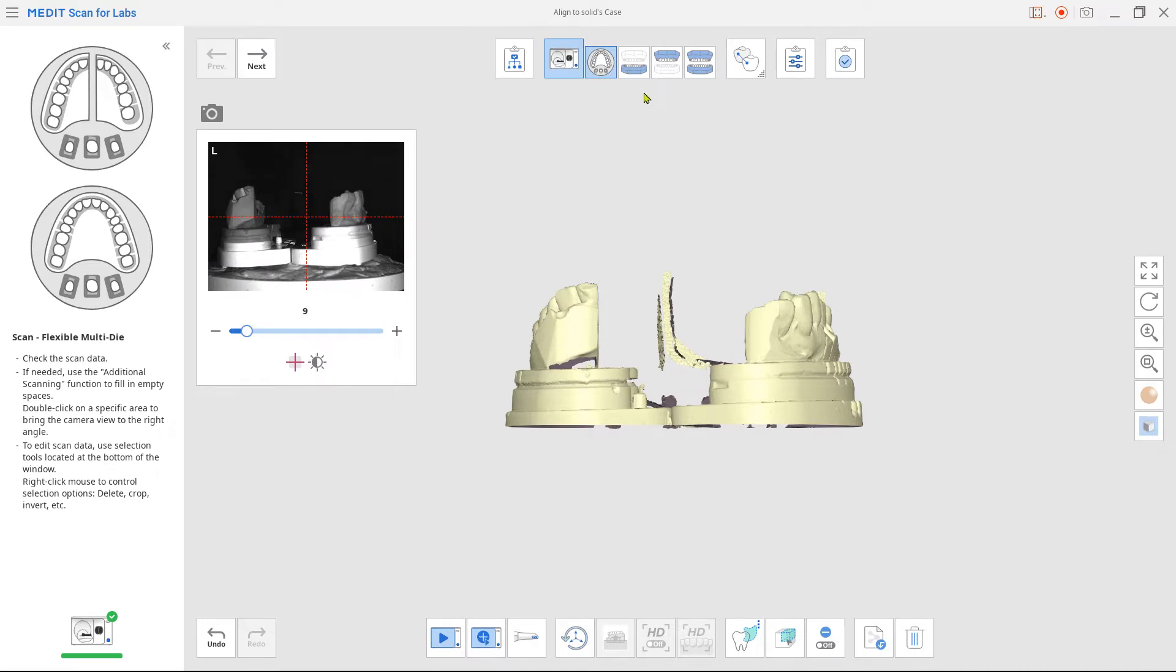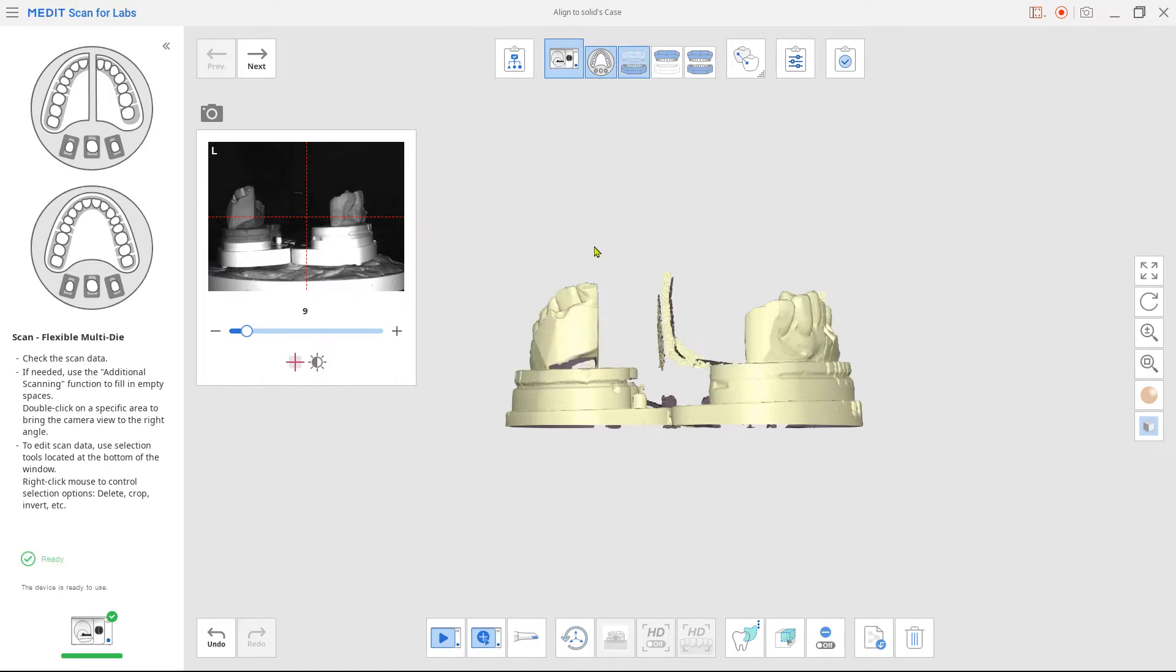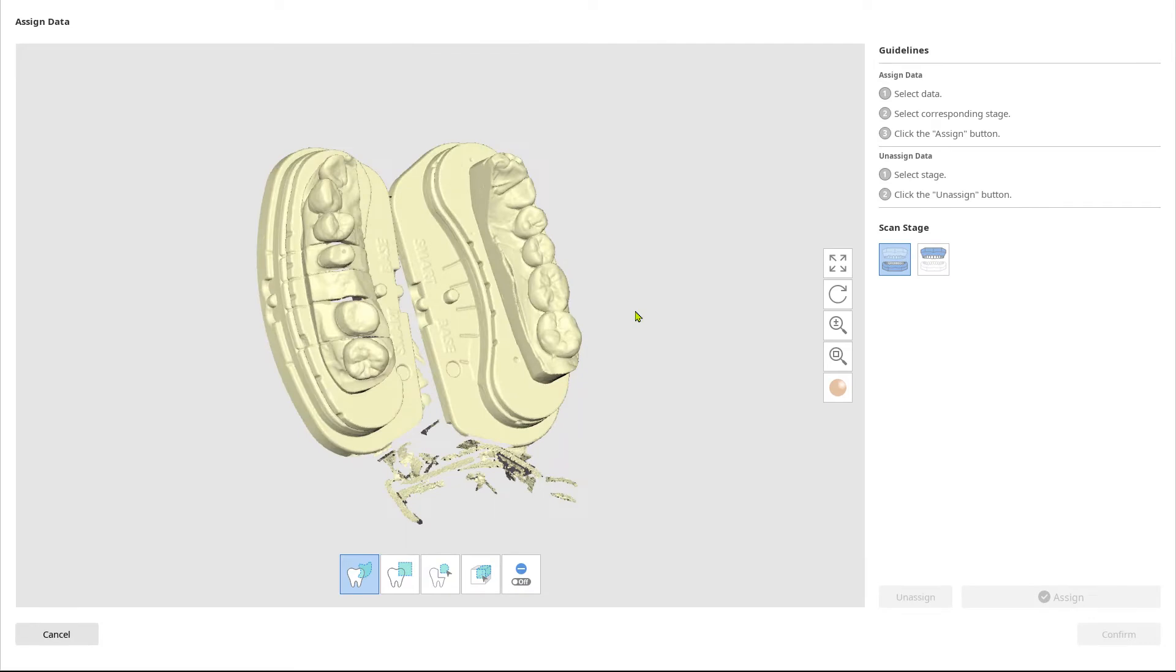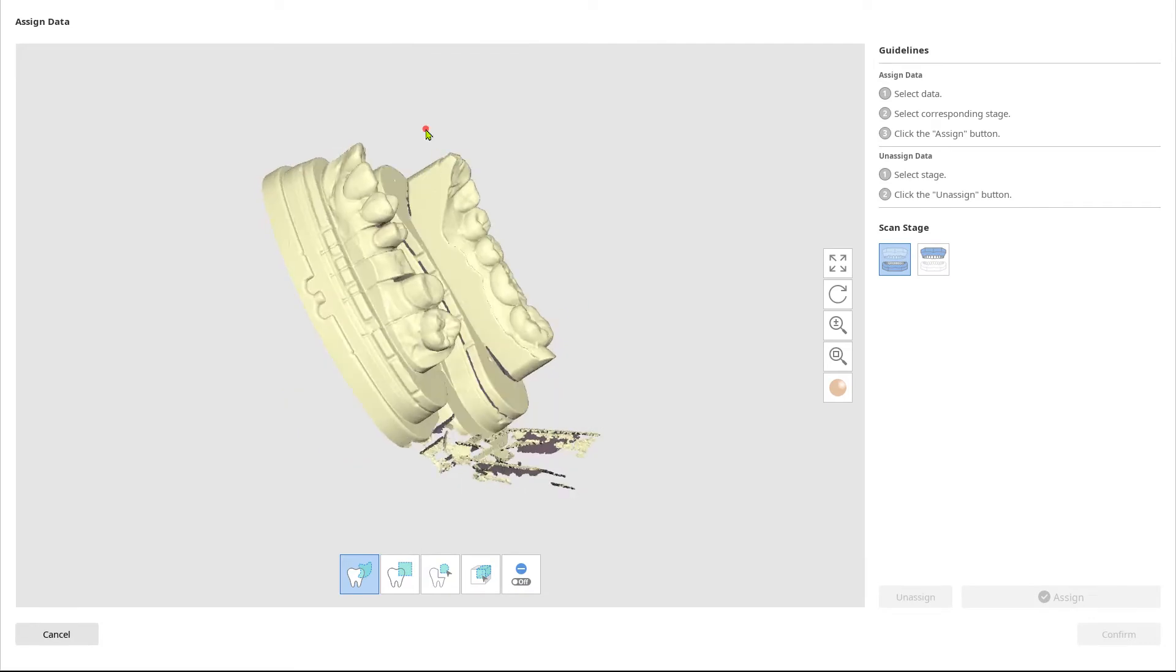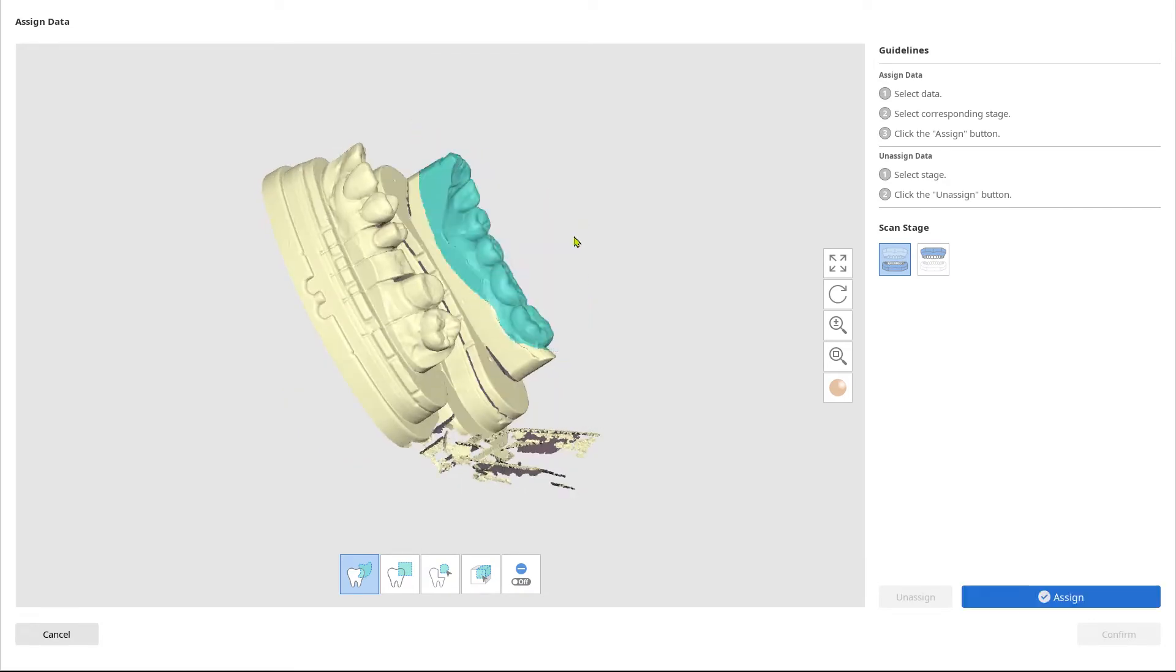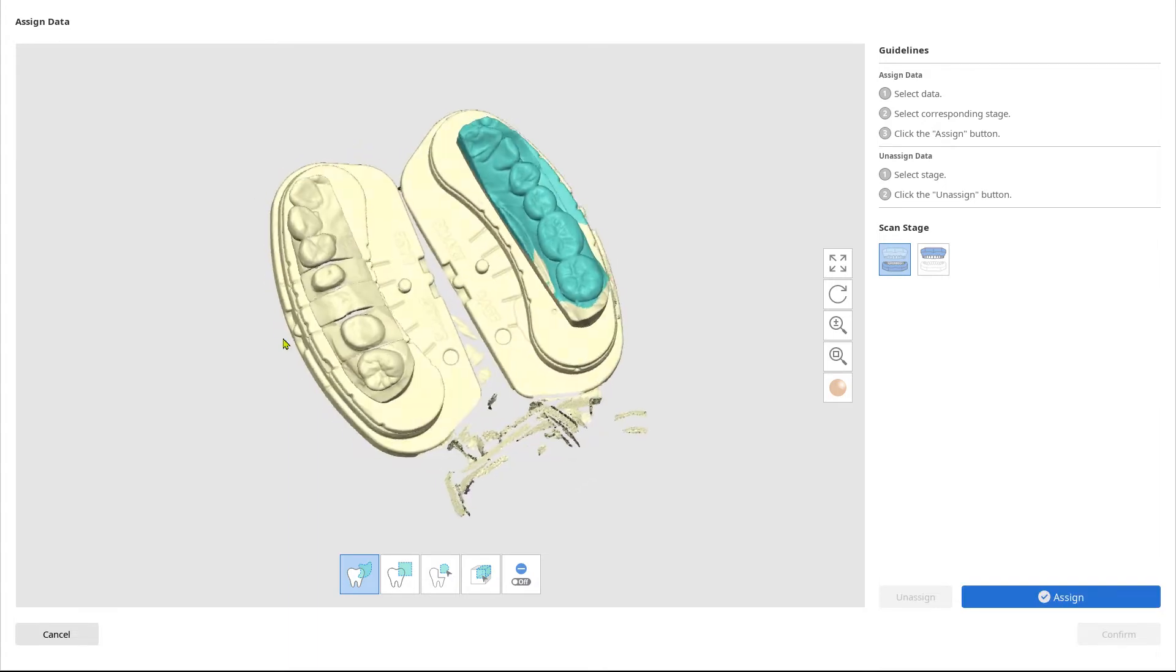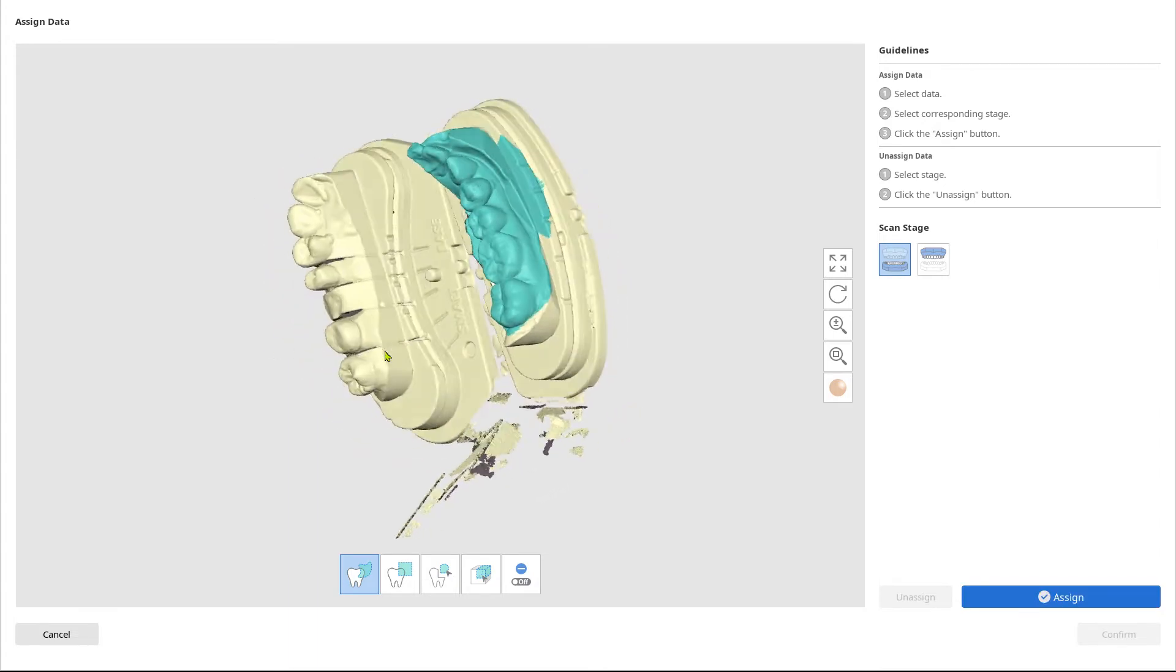Click on the mandible. Now you can select the area which belongs to the mandible. Assign data to the mandibular base from the right scan stage.